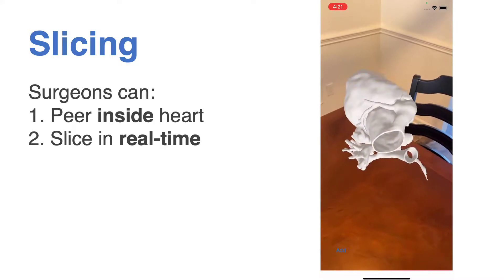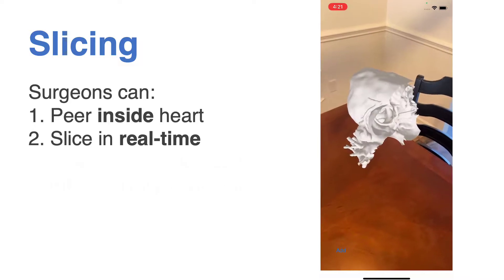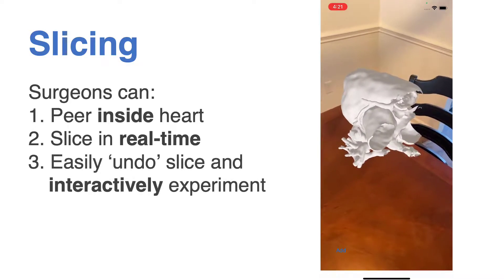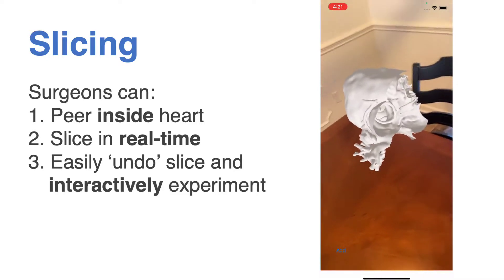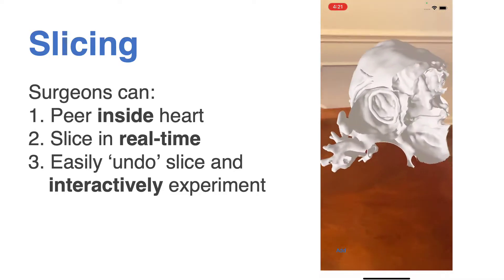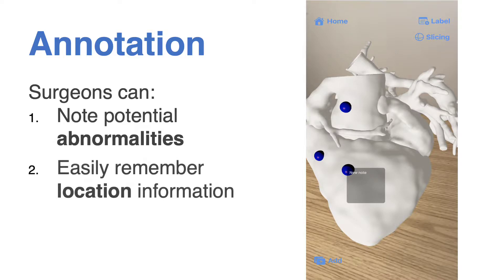The slicing plane can be rotated and translated to allow for different views of the heart's internal structures. Cardiac AR gives surgeons the opportunity to interactively slice and see various structures of the heart to better site potential abnormalities. If a surgeon spots an abnormality, they can easily take note of it with our annotation feature, which allows surgeons to easily remember the spatial location of an abnormality and any issues they may have forgotten.